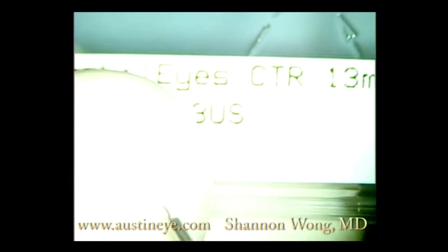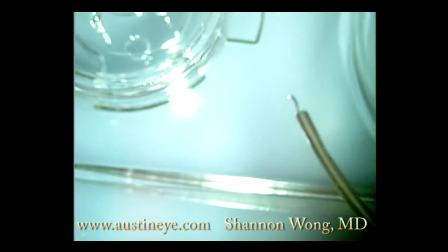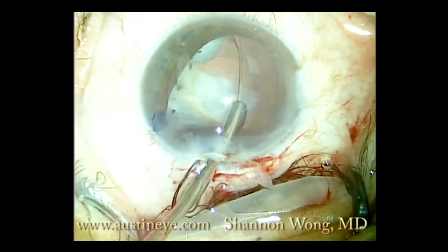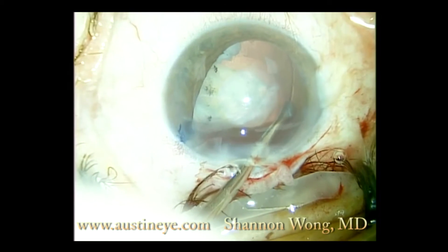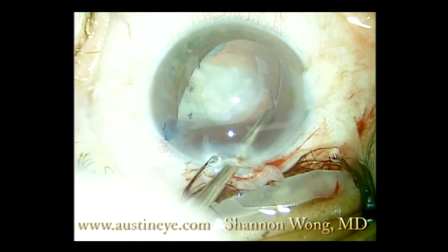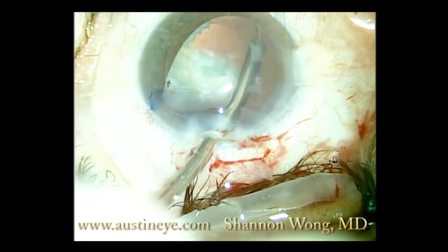Since this is his only seeing eye and his other eye is not functional, we elected to use a stabilized capsular tension ring made by Advanced Medical Optics. We inserted this capsular tension ring into the bag after we had taken out probably about half of the cataract. The capsular tension ring goes in fairly easily because we have debulked a majority of this cataract already.